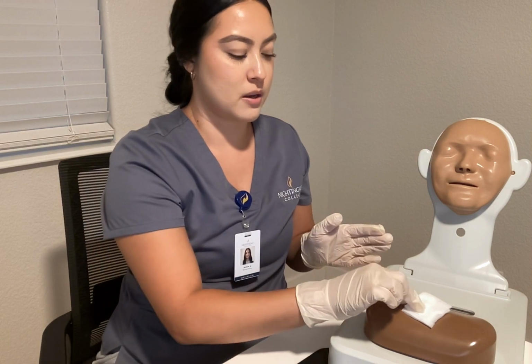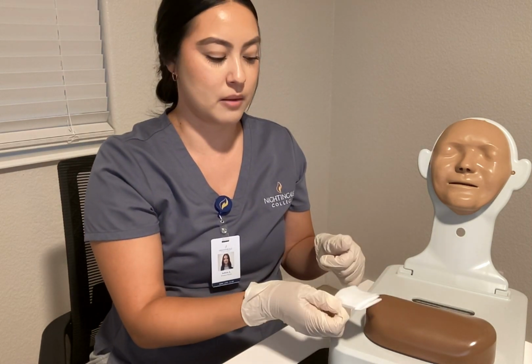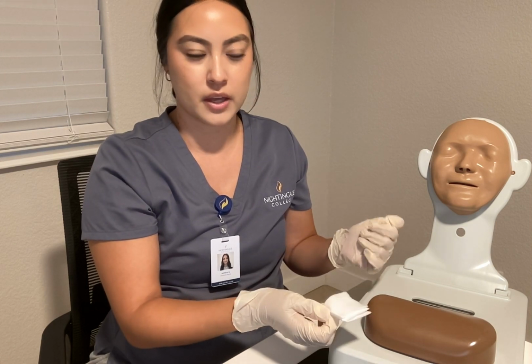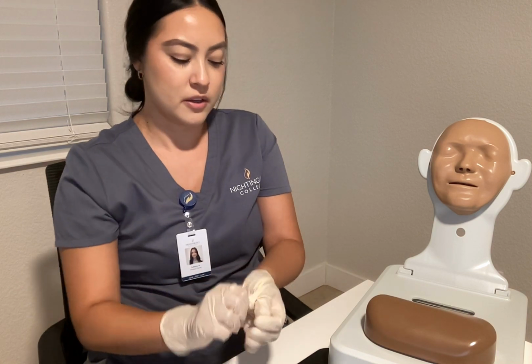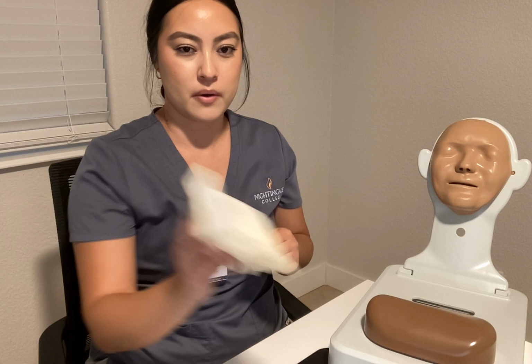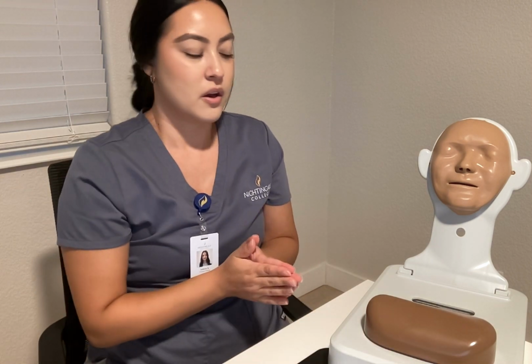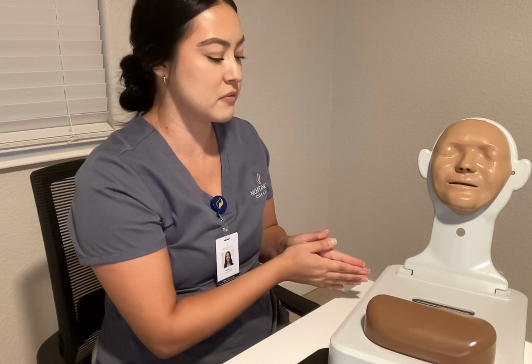If there was any blood or the patient would like a Band-Aid, I would apply it lightly over the area. Okay, Mr. Smith, are you feeling okay? You did awesome. Okay, I would go ahead and trash those. Okay, Mr. Smith, everything looks okay. I would go ahead and put you back in a comfortable position.